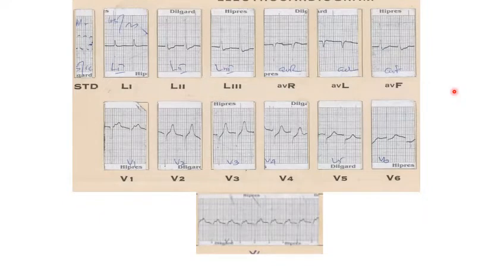Sir, so this is a 12-lead standardized ECG, which is showing absence of P wave preceding the QRS complex, which is seen in 2, 3, AVF. And actually, the P wave is inscribed after the QRS complex. Yes, very good. Yes, in 2, 3, AVF. Yes.